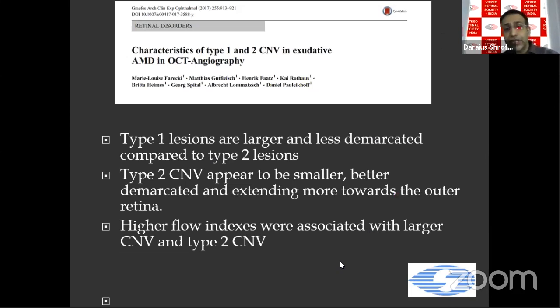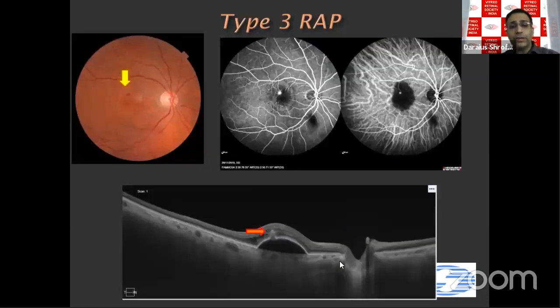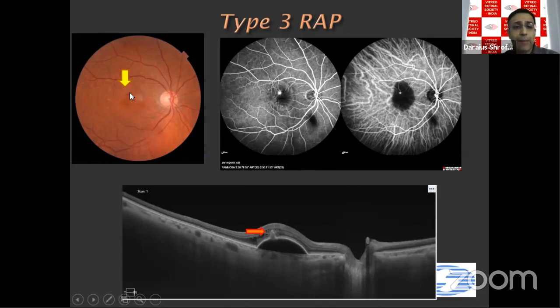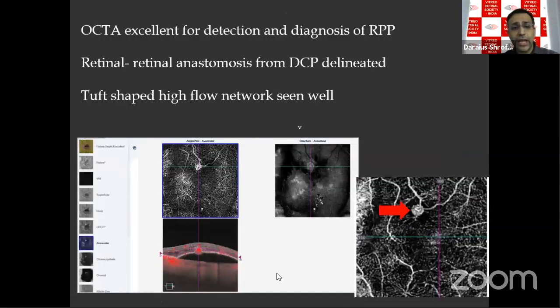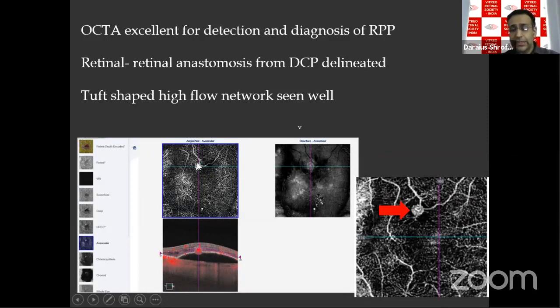Studies comparing Type 1 and Type 2 CNV show Type 1 are larger and less demarcated; Type 2 are smaller, extend toward the outer retina, and have higher flow indices. Moving to RAP (Type 3): a characteristic hemorrhagic dot is a clue, the hot spot is seen on ICG, and the intraretinal tissue is seen on structural B-scan. OCTA is excellent for RAP because the retinal anastomosis from the deep capillary plexus is well delineated and a tuft-shaped high-flow network is visible.